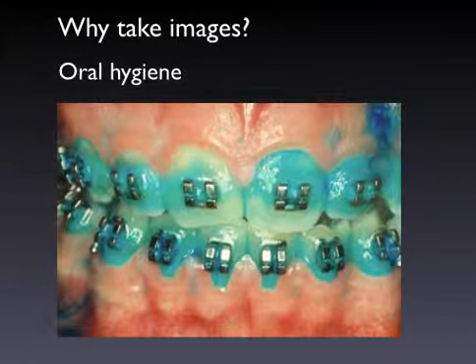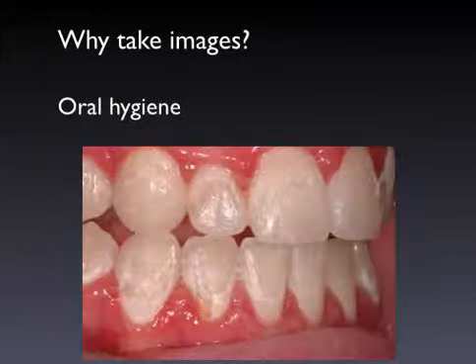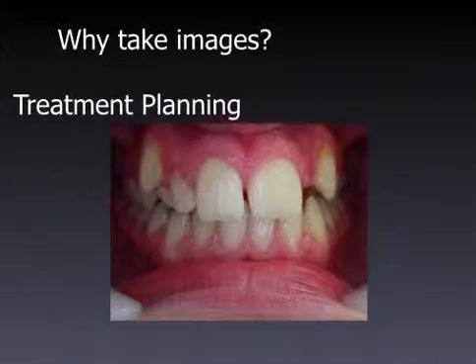So the patient who doesn't brush the teeth, obviously we can use disclosure tablets to stain the plaque and help identify the bits that they've missed. And if they don't clean the teeth, we can show them what's likely to happen. Demineralization, white spots, dark spots. And also in the treatment planning stage.